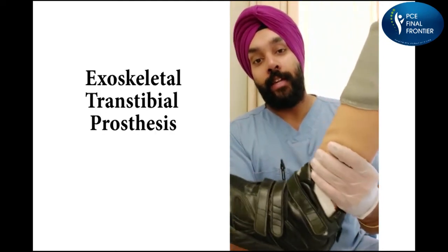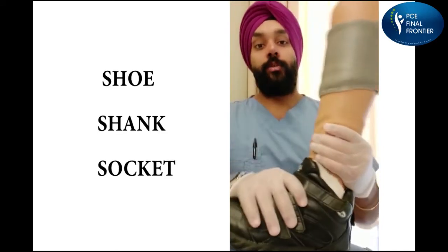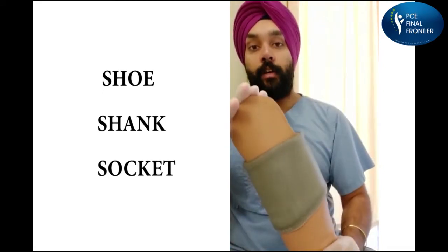Alright team, as promised, I'm going to show you some devices today. So let's start with the prosthetic device. The first is the Exoskeletal Transtibial Prosthesis, right? Okay, now if you can see, there's a shoe, there's a shank, and there's a socket.